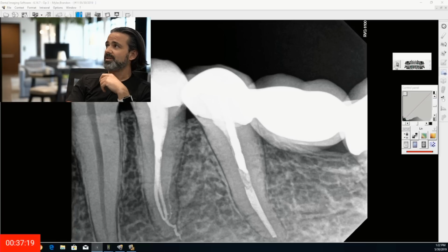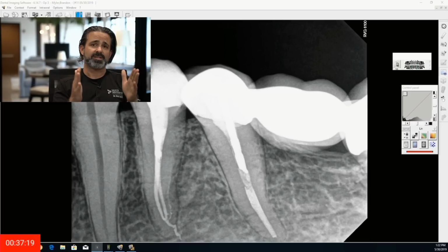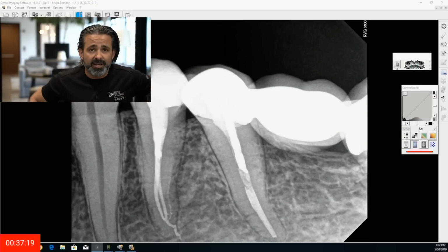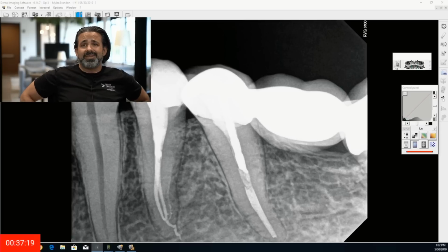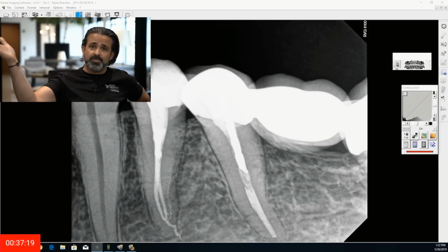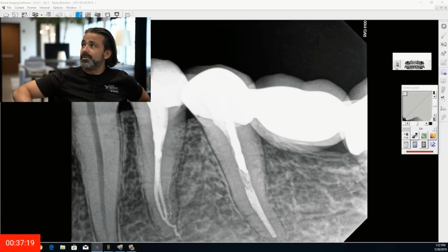And so it's a really interesting technique, and you know, it's a little bit out of place because I ran the GentleWave up front, and again, I kind of felt forced into it, and I think it was a safety thing for the patient. I mean, it made me safer. I was getting worried about those files. That was quite a tight fit, and I was happy to reach my working time goal of under 40 minutes. And I feel like this was a great service.